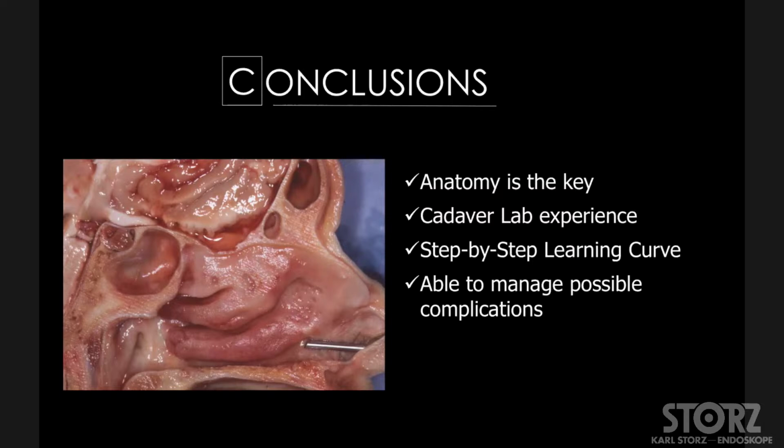Another important thing to understand is that you have to follow a step-by-step learning curve. You cannot start from very difficult cases. You cannot start from cancer of the skull base, but you have to start from very easy cases. You can start from maxillary sinus, fungus ball, polyps, and so the learning curve should be respected, starting from easy things and then moving day by day, step by step, to things much more difficult, and only at the end manage very complex cases such as revision frontal sinus, revision sphenoid sinus, benign and malignant tumor of skull base, repair of CSF leak.